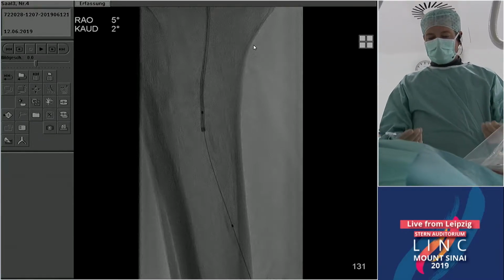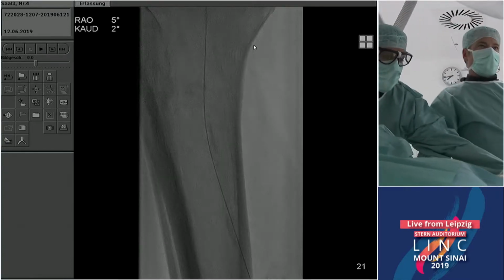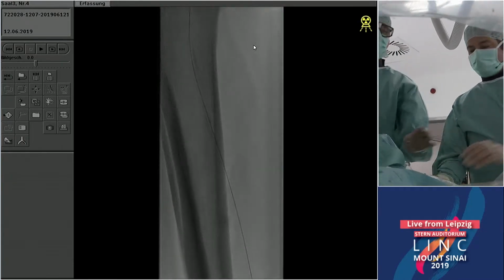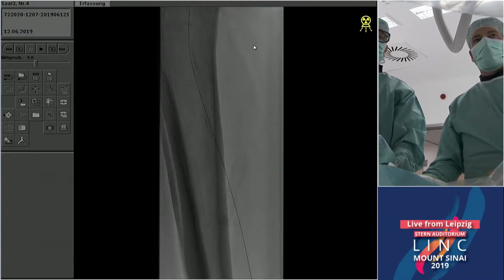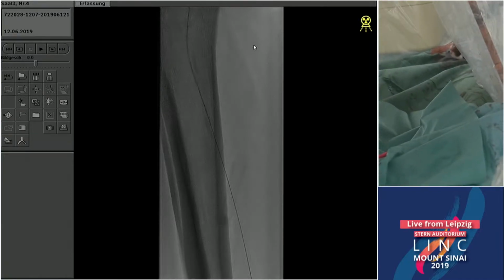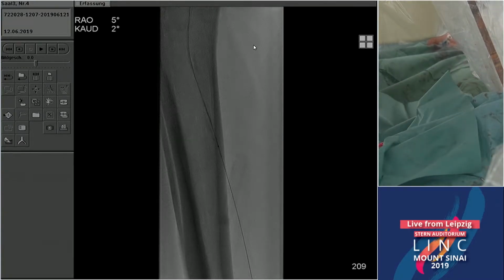I don't know. Would you have escalated with your wires from antegrade a little bit? Poking around in no man's land where you don't know where to poke, I think is a little difficult maybe. No, I think that was a beautiful example of how something is very difficult to wire antegrade with all those little collaterals and how easy it was retrograde.